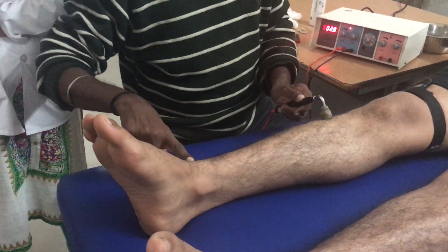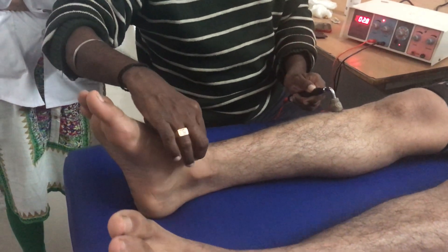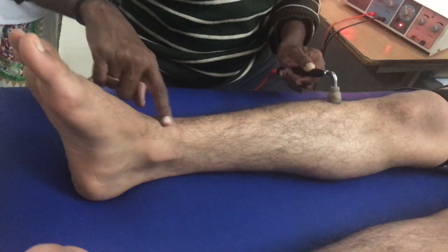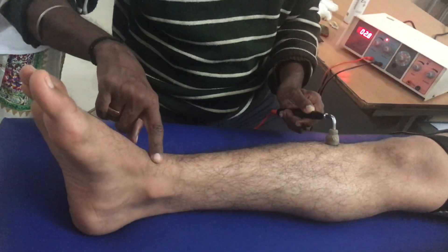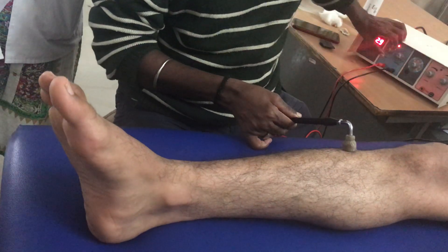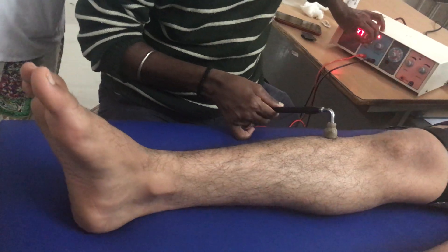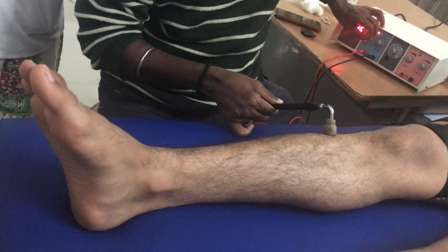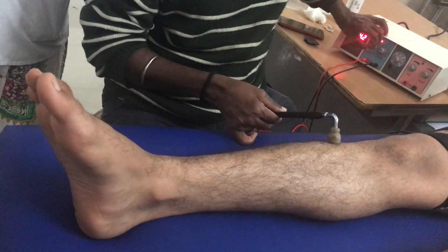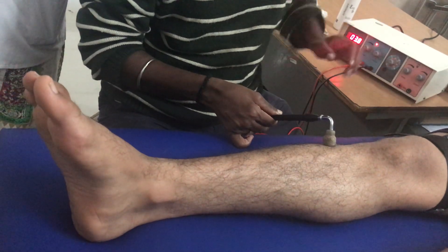I will tell you how to differentiate the tibialis anterior, EHL, and extensor digitorum longus later. But you should understand that the thickest and the medial-most muscle is your tibialis anterior. He is having no contraction at all, so I am going to increase the intensity slightly more.